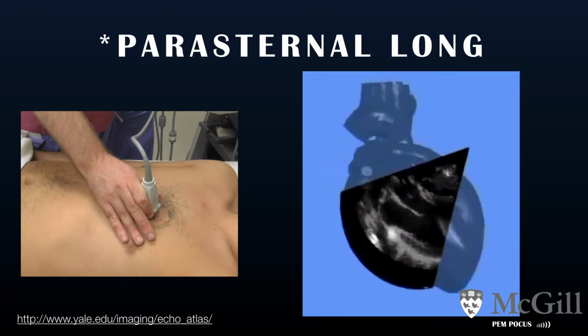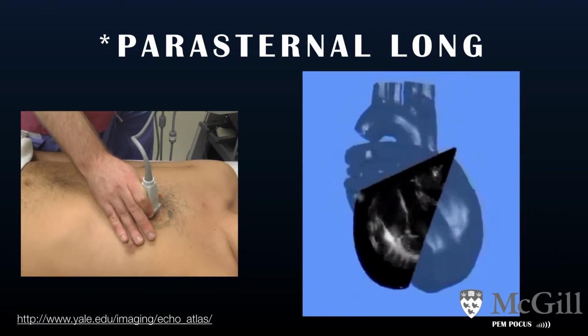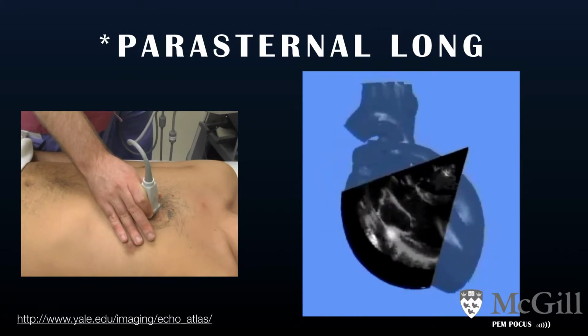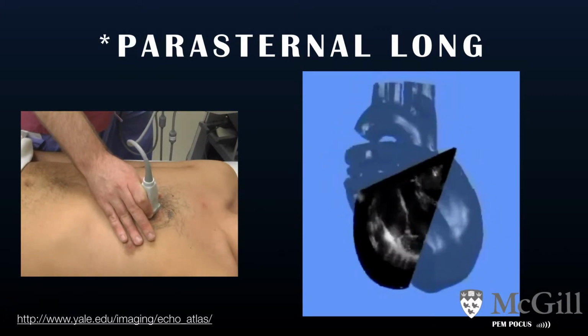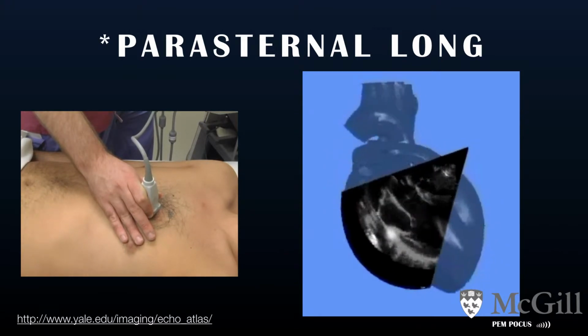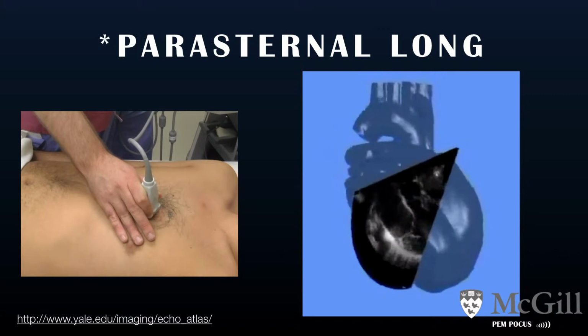The second view obtained is the parasternal long view, which is obtained by placing the probe in the 2nd or 3rd intercostal space at the left sternal border, with the probe marker oriented to the right shoulder. This will allow for a sagittal view of the LV.